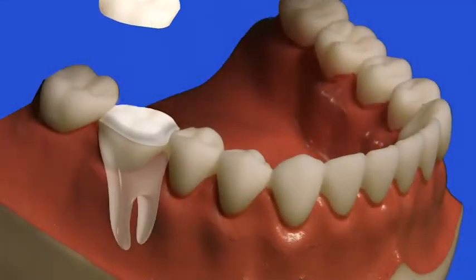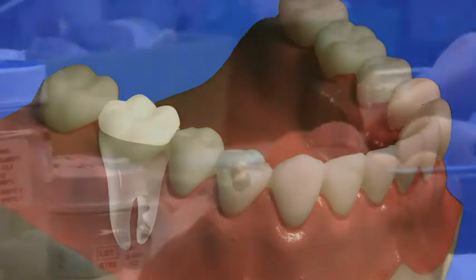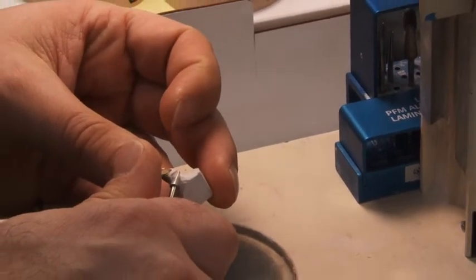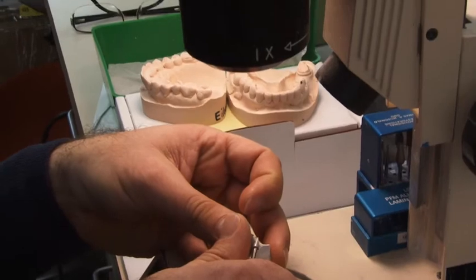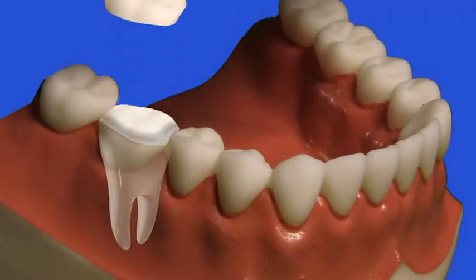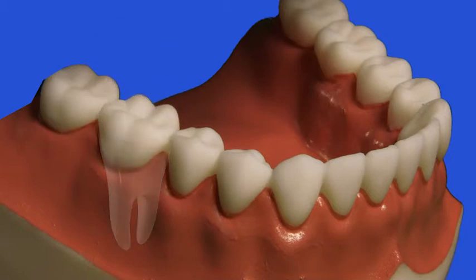Your dentist will custom make a temporary crown to be worn while the final crown is being made. The final restorative crown will be made in our on-site dental lab. You will be scheduled for an appointment to complete the cementation of your crown. At your appointment, the temporary crown will be removed and the final crown will be adjusted as needed and cemented to the tooth to complete the restoration.